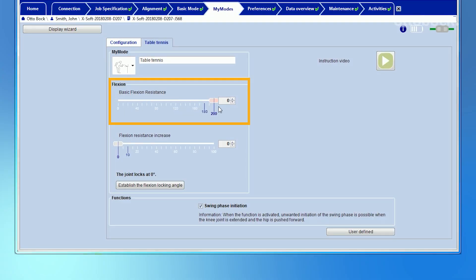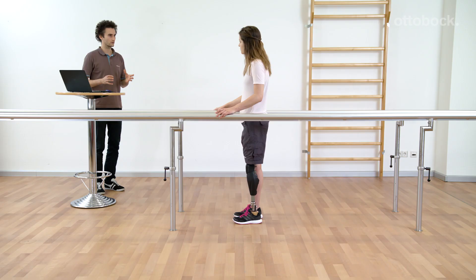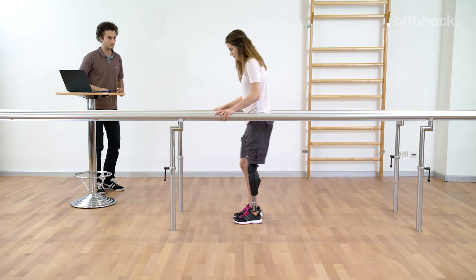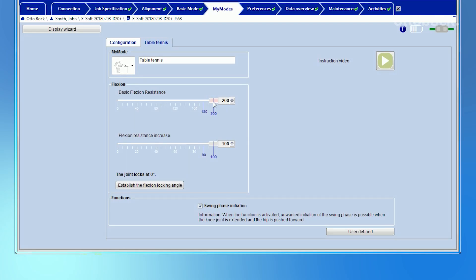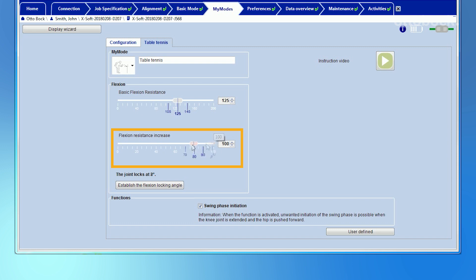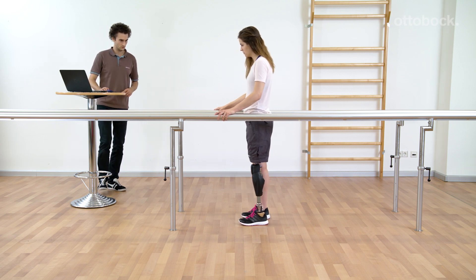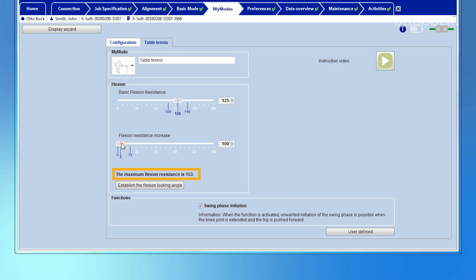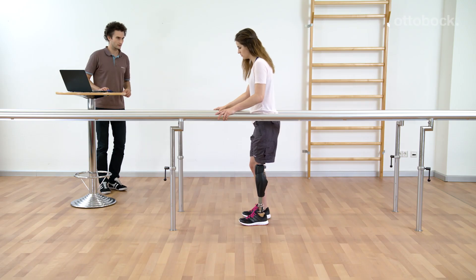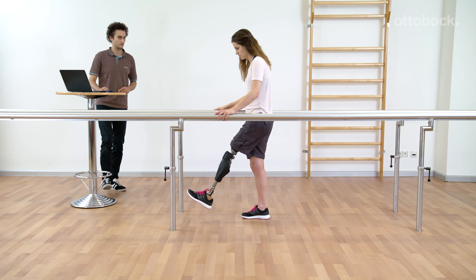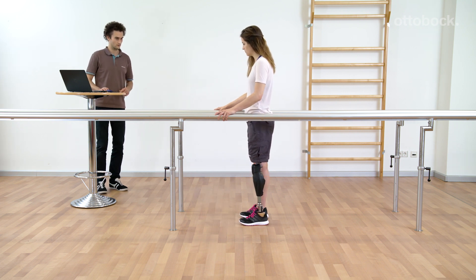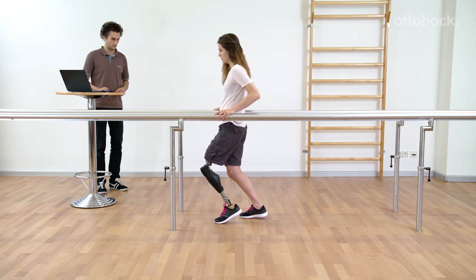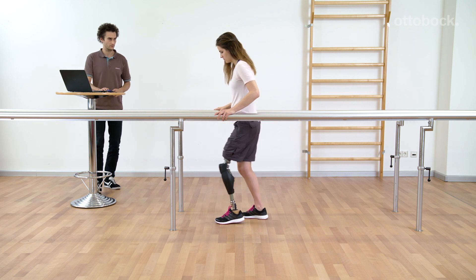If only the basic flexion resistance is set to the other end of the scale at its highest level, the knee joint is locked in full extension. It is also possible to create a My Mode where the knee will not lock. Set the flexion resistance increase to a very low value or zero and the knee will move through the full effective range of motion against the controlled resistance. In this case, the flexion resistance is set to 153. Due to the moderate basic flexion resistance and the low flexion resistance increase, the knee joint is not free swinging and does not lock. The user experiences a dampening behavior which increases gradually from the basic flexion resistance up to the displayed value from 0 to 90 degrees.